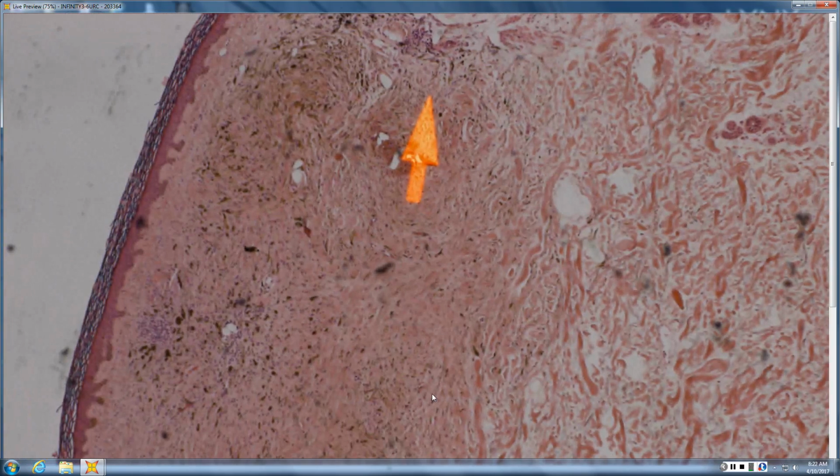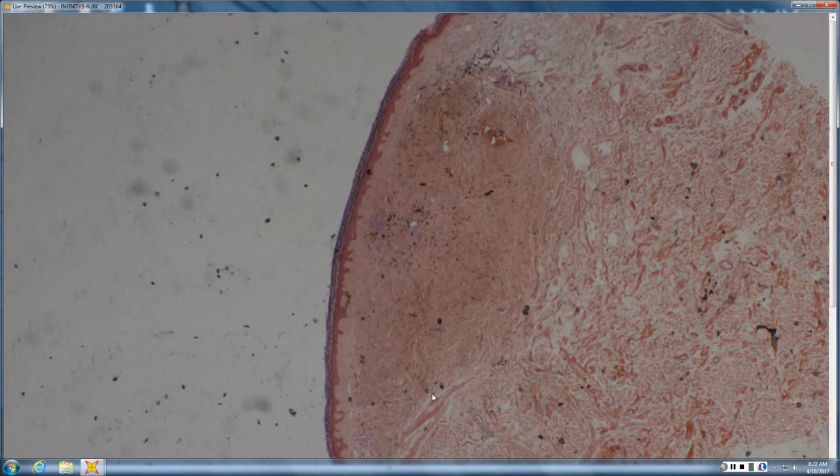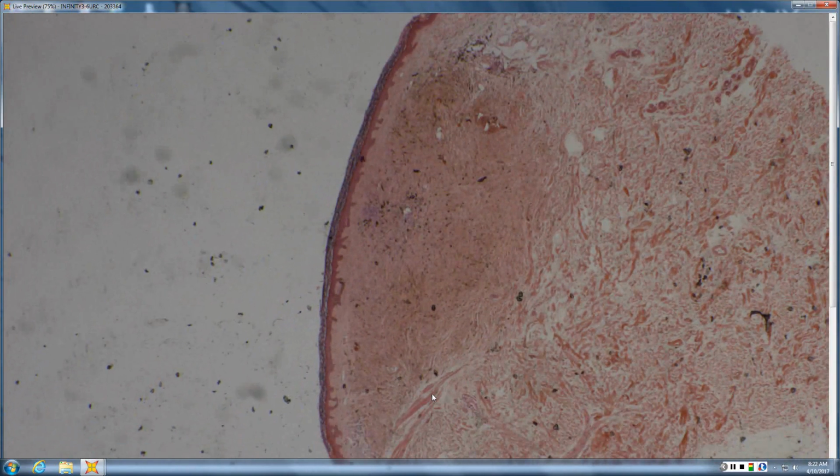Focus, it looks like a blue nevus. Now, are you worried about this one being a blue nevus-like uveal type melanoma? Yes or no, and why? I don't think so. Looks like it has its own background stroma. It clearly has its own stroma that's not just the background dermis. So that goes with a blue nevus. If that were absent, then you start thinking, should I get a BAP? Should I get a MIB? Should I look for a possibility of uveal melanoma of skin?